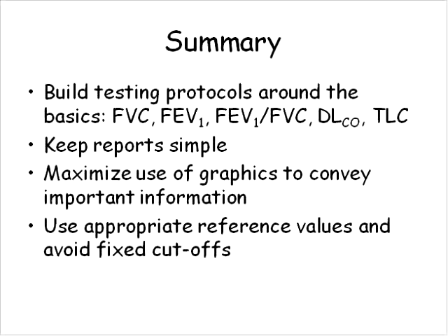I think that because most of the bronchodilators that are used have a minimal effect on the cardiac output, there's probably not a great deal of change in diffusing capacity that's done post-bronchodilator, but it's probably important that you somewhere on the report indicate to the interpreting physician that the patient's DLCO was measured after the administration of bronchodilator. In our lab, we simply make sure that those DLCO measurements, whether adjusted or unadjusted, show up in the post-bronchodilator column, and we make sure that the physician interpreter is aware of how the test was performed.